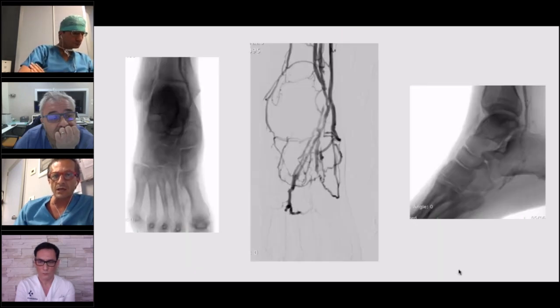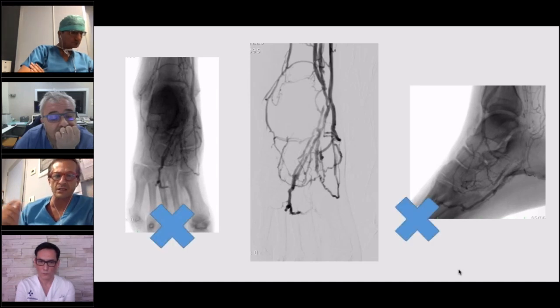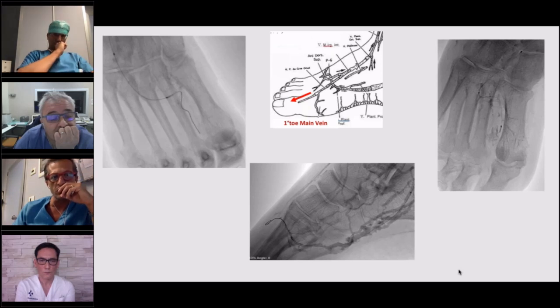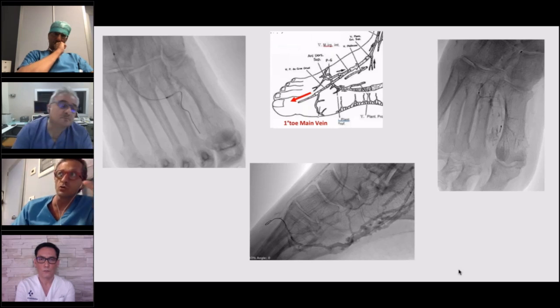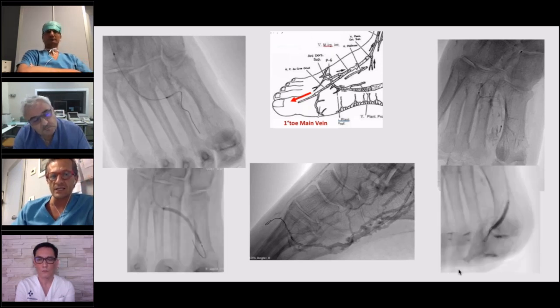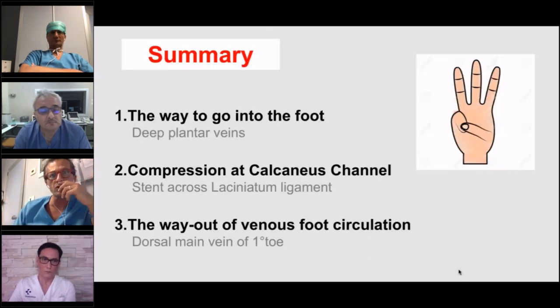But when we arrive at this level, the flow into the foot seems to be in a roundabout, without flow into the forefoot. This is because the most important way out of our flow is the dorsal main vein of the first space. This vein, conversely to the perforator vein, has 2 or 3 valves. So usually we have to navigate this vein to cross the valves and at the end devalvulate it, usually with a venoplasty, in order to obtain a good flow also into the forefoot.